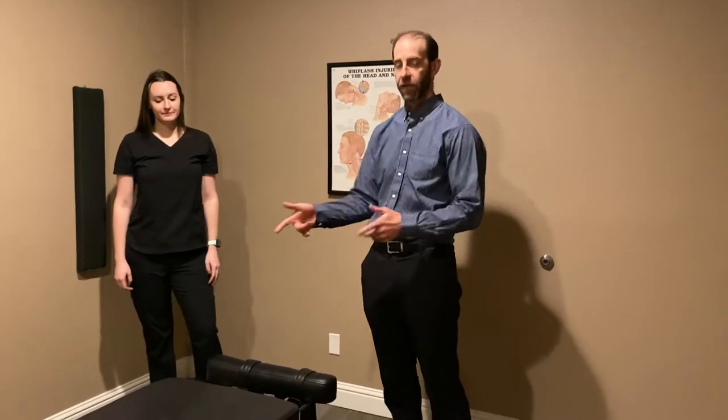Hello, this is Dr. Welch from Northern Nevada Chiropractic. Today I wanted to show you our flexion distraction table.